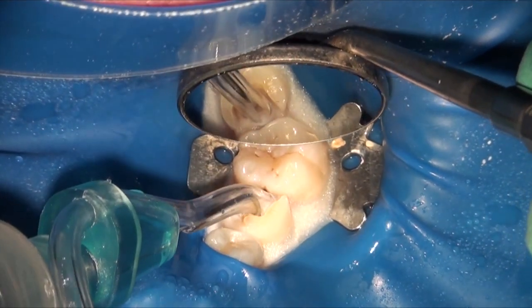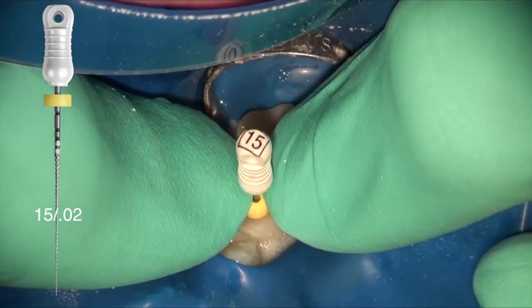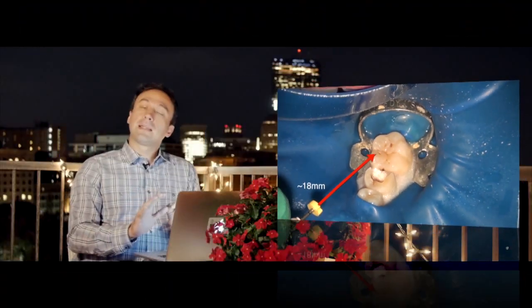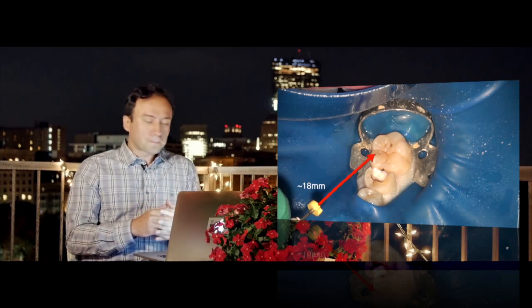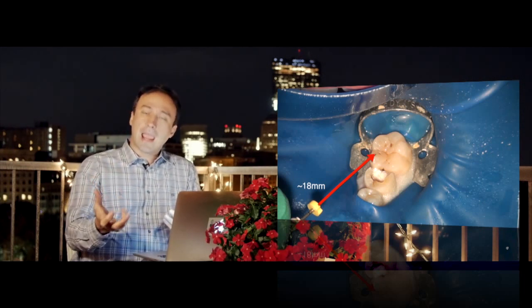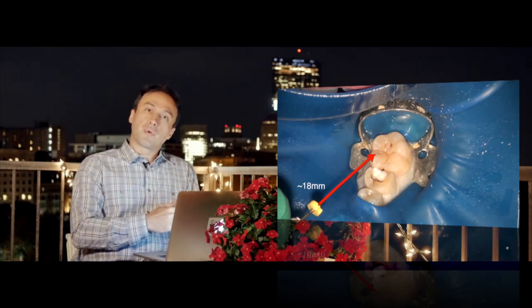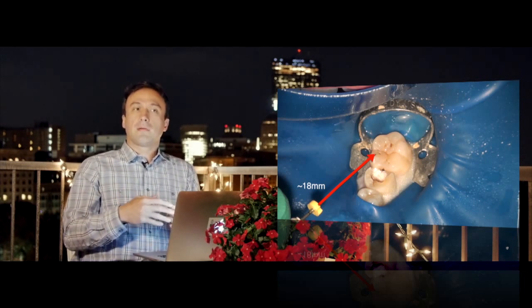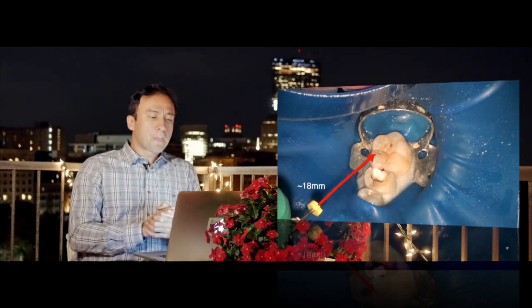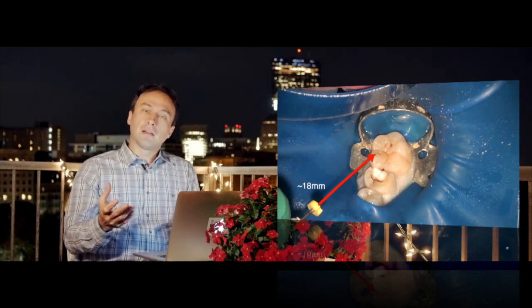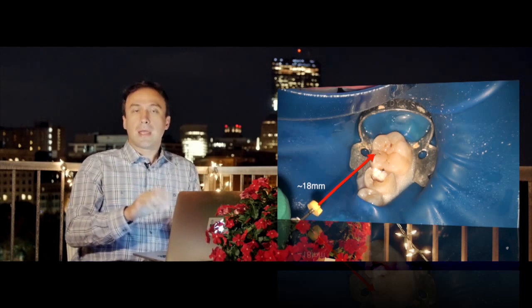I now have my access preparation. I put in some canal clean, which is Rebold Endo's EDTA solution with a surfactant. I'd like to introduce the concept of available length. Every time you open into a root canal, you use a size 15 hand file to determine your available length. You have established from your preoperative radiograph an estimated length, but the concept of available length uses your size 15 hand file — without heavy instrumentation — placed down into the canal after opening, to see how deep it goes, and you make note of that length.